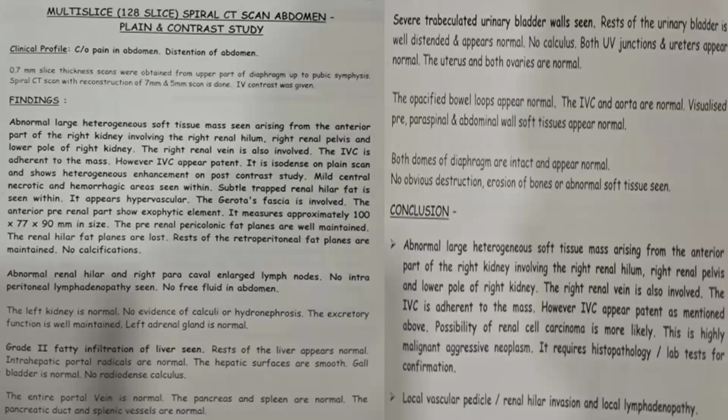There was an abnormal large soft tissue mass seen arising from the anterior part of the right kidney, involving the renal hilum, right renal pelvis, and lower pole of the right kidney. Renal vein was also involved. IVC was adherent to the mass. However, IVC appeared patent. Isodense on plain scan, it showed heterogeneous enhancement on post-contrast CT. Mild central necrotic and hemorrhagic areas were seen. Subtle trapped renal hilar fat is seen within, and it appears hypervascular. Gerota fascia was also involved. The anterior pre-renal part showed an exophytic element and measured approximately 10 cross 7.7 cross 9 centimeters in size. And there were abnormal renal hilar and right paracaval enlarged lymph nodes.